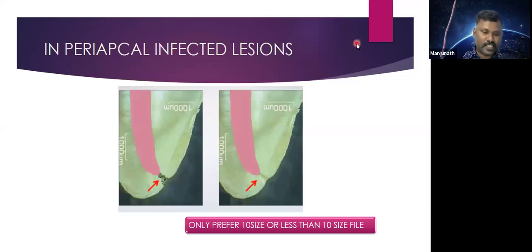நீங்க பண்றதுனால என்ன advantage அப்படின்னா the apical terminal portion, that is the constriction portion ல இருந்து apical foramen வரைக்கும் more accumulation of debris will be there. Infected particles அதிகமா அங்க தான் accumulate ஆயிருக்கும். So in order to do the patency check, நீங்க அந்த ஃபைல உள்ள இன்சர்ட் பண்ணி apical foramen தாண்டி போயிட்டு வந்துட்டீங்கன்னா these areas will be clearly cleaned with your patency check. அதை நீங்க ப்ராப்பரா பண்ணிட்டீங்கன்னா periapical infection regionsல success rate வந்து உங்களுக்கு நல்லா இருக்கும்.